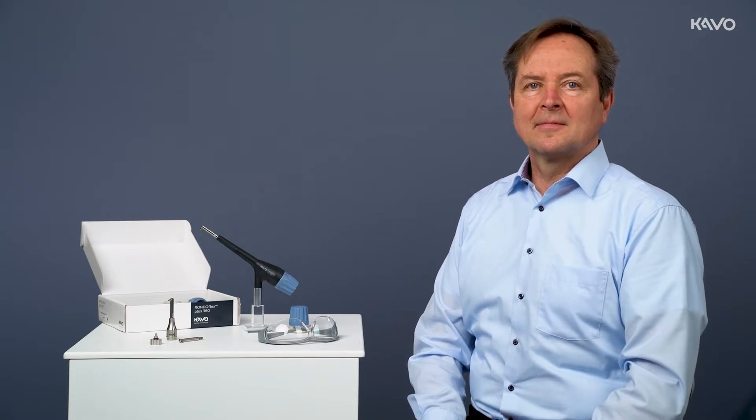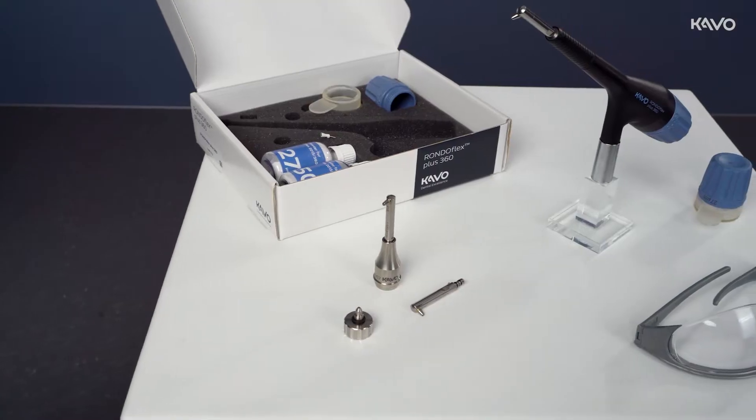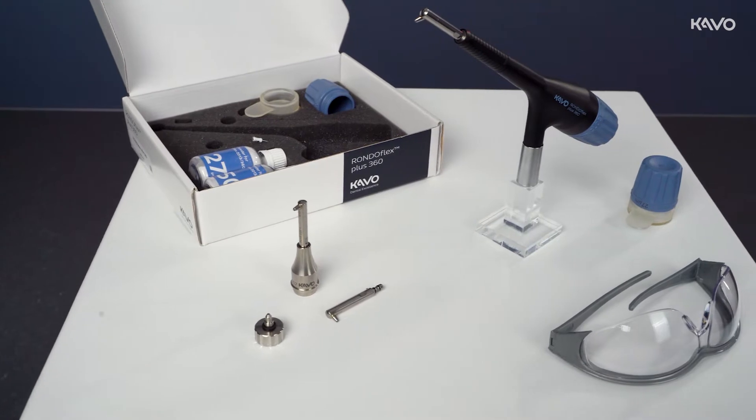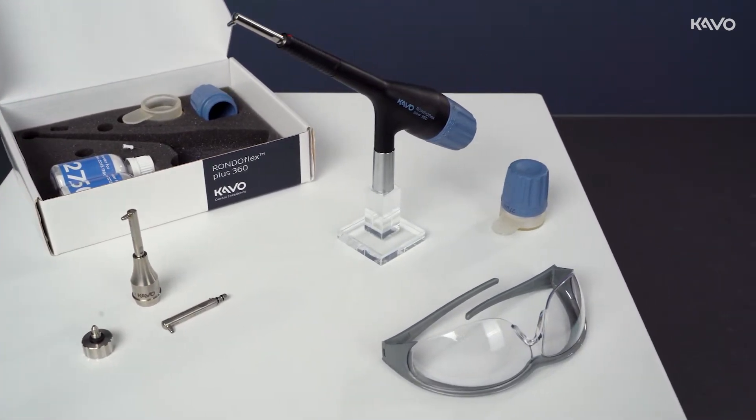Typical areas of application include the removal of composites for repairs, the preparation of small lesions and fissures, and in particular the surface preparation of various materials before applying adhesive techniques for better adhesion.